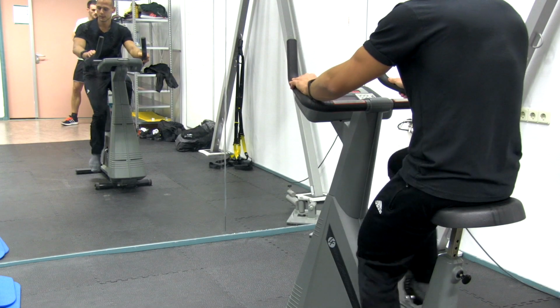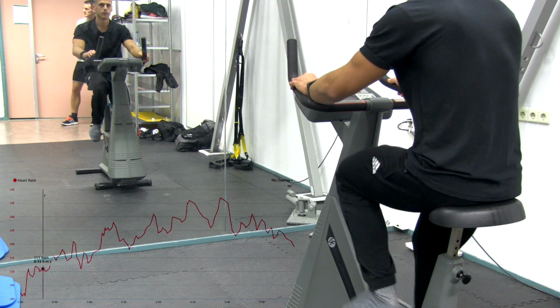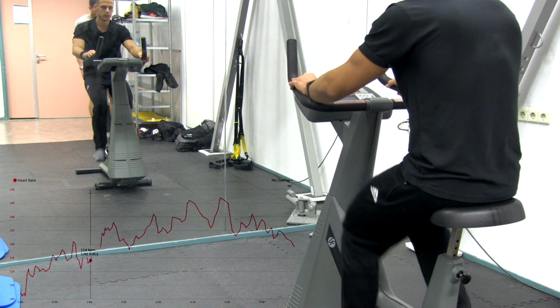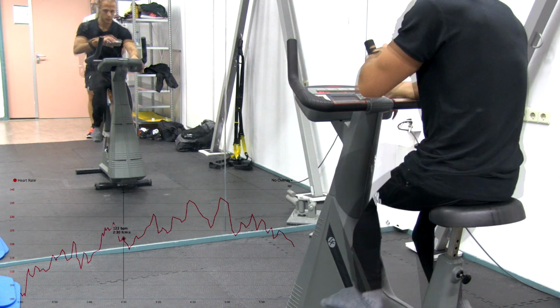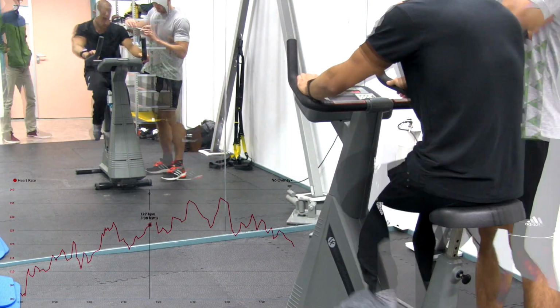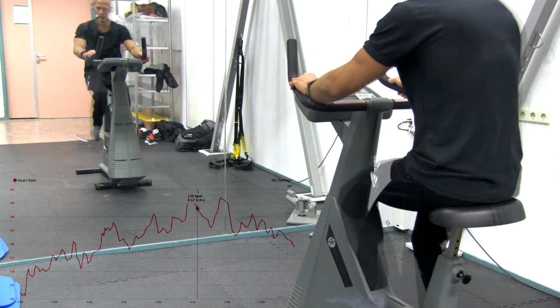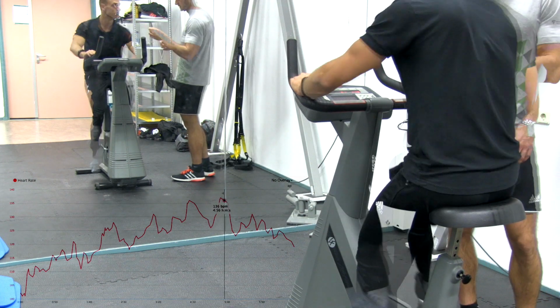Start the stopwatch and ask the individual to start biking with a wattage set to 100 watts for females and 150 watts for males. Make sure to record the heart rate after each minute, either by software or with a score sheet. The goal in the first 2 minutes is to reach a steady heart rate close to the target heart rate, so you might have to adjust the watts in small increments during the first 2 minutes only. In our case, we had to raise the wattage from 150 to 160 watts to reach the calculated target heart rate of 135 beats per minute.